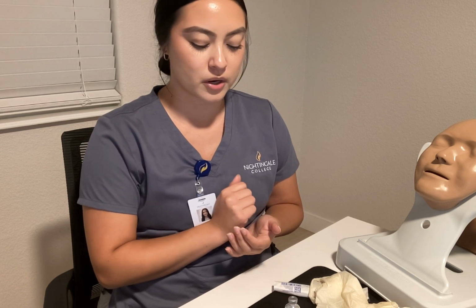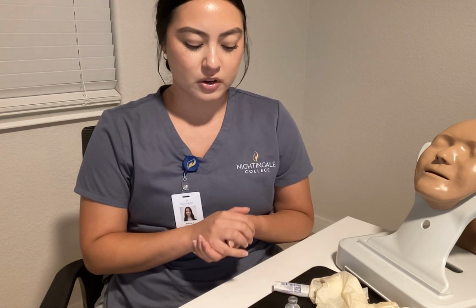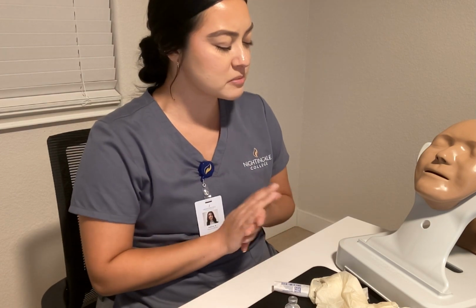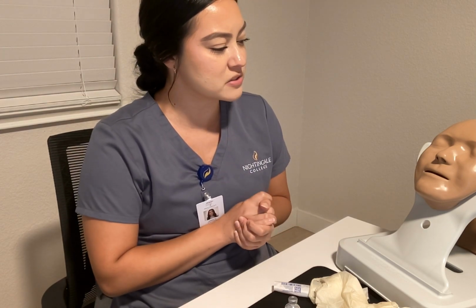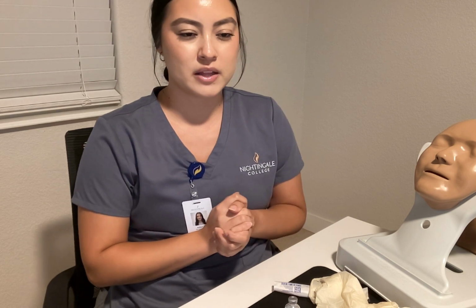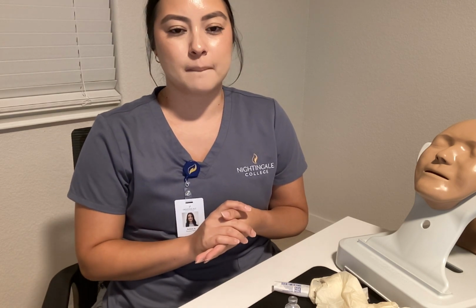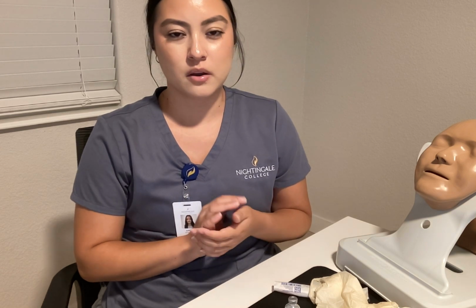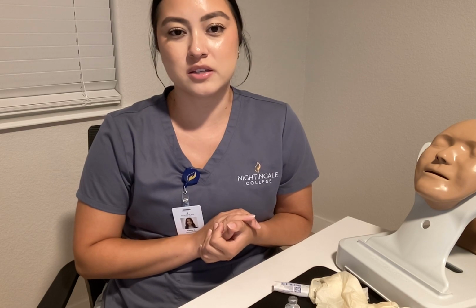So at this time, I would go ahead and grab a second nurse so they can also verify and watch me draw up the insulin. Mr. Smith, do you have any questions before we get started? Okay, perfect. No questions at all. So before we start our insulin draw up, our patient's blood sugar this morning is 300, so he is going to get some insulin.